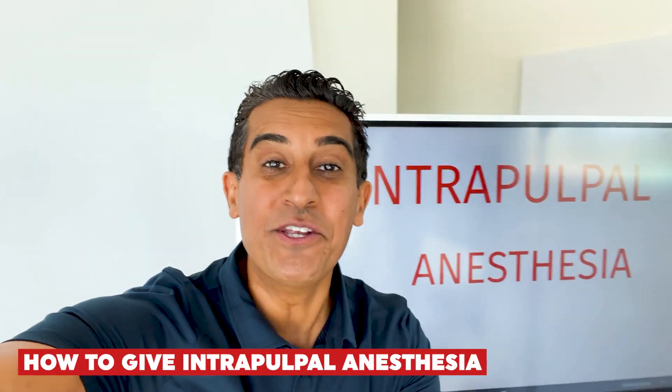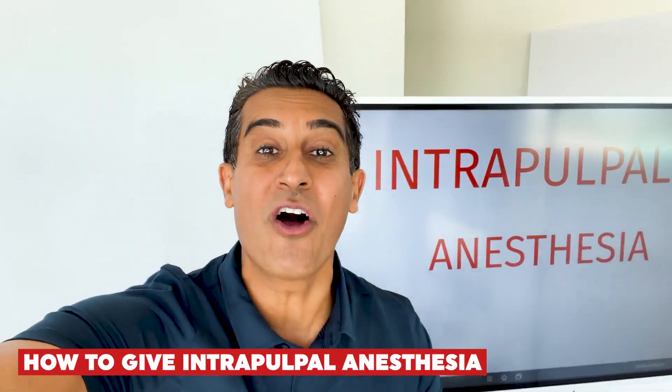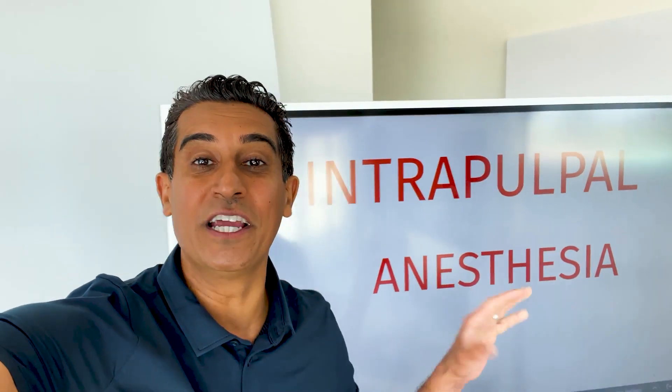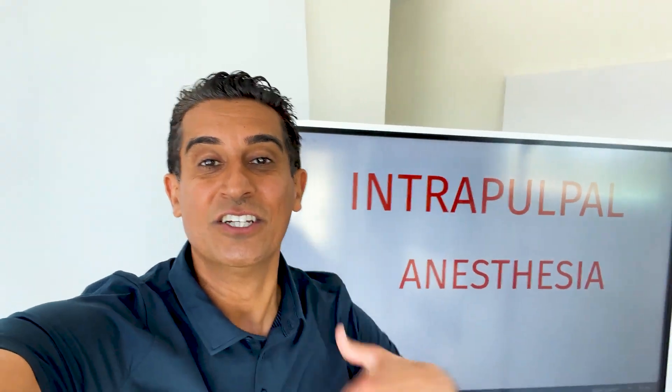Hey, it's Dr. Ganantra. Have you ever been doing endo and it's just so hard to get the tooth numb? It's a hot tooth. How do you numb it up? I'm going to have Dr. Gilbert walk us through intrapulpal anesthesia — how do you anesthetize that tooth that you've opened up while you're doing endo on it? Dr. Gilbert's going to walk us through exactly how he does it. Hopefully it'll help you too.